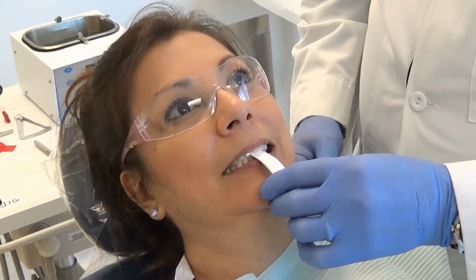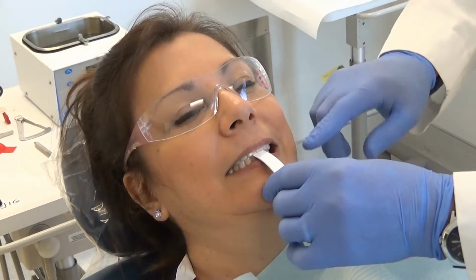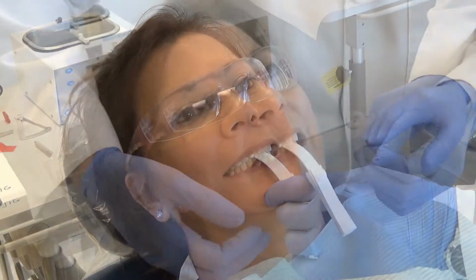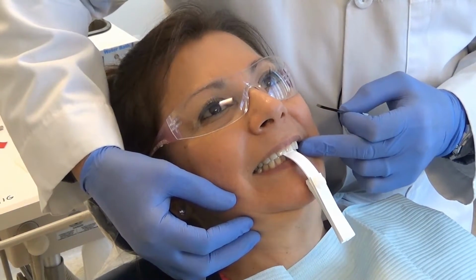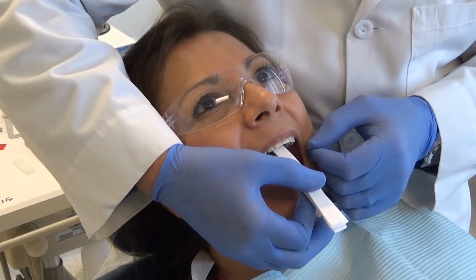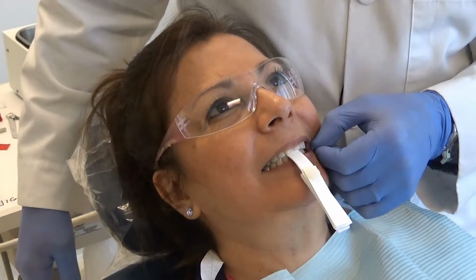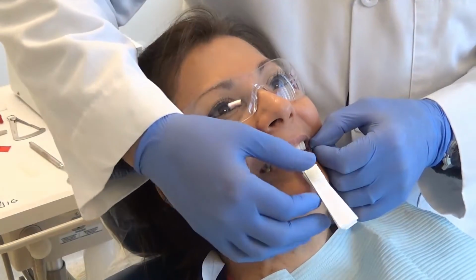Open. Close. 6. Did you feel something touch? Okay, so she feels something touch. So what we would try to do is to find out exactly which tooth touched. Okay, so my patient feels like something's touching right here in about the middle of her mouth. Go ahead and open and close. Open, close, and there it is right there. So she's touching on her second molar. That's her first point of contact.